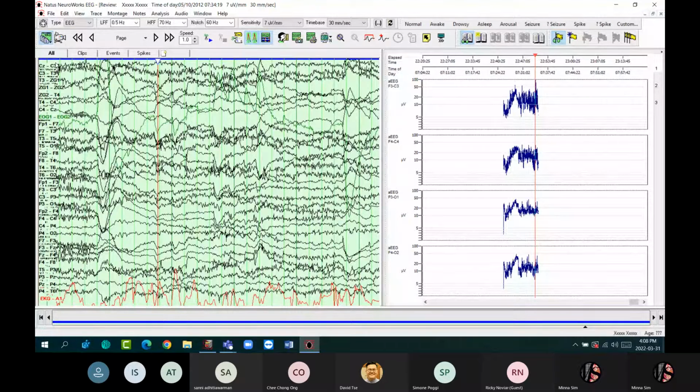Any questions? Okay, just one question. Before that, you can change the analysis profile for one patient, right? Is it possible to move patient data from another unit to this unit, and then we check the analysis profile using the entrance? Can it be read in this unit? Are you asking whether you can use the same analyzer for different patients, from another PC? Yes.